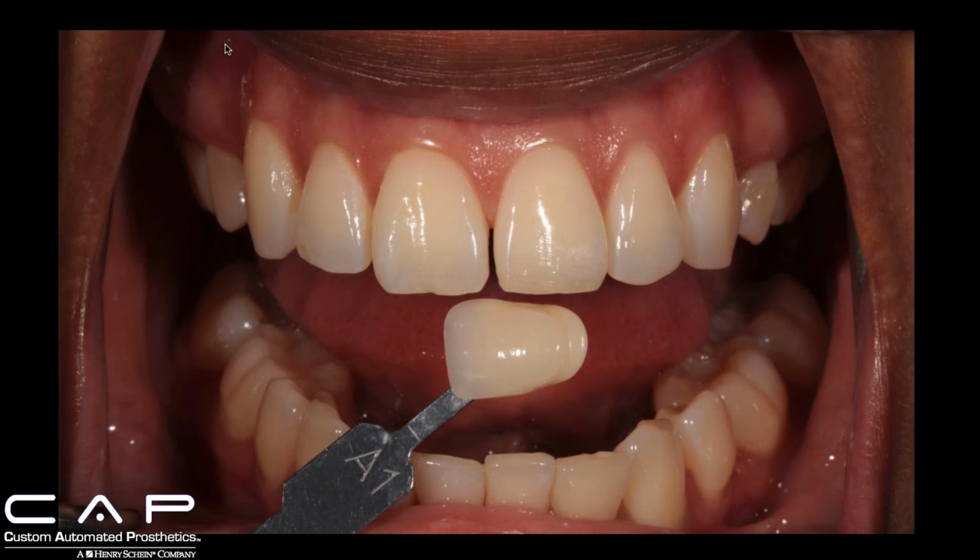So this is how I take a photo for basic shade taking. You can see she has her retractors in that she's controlling with her hands. I just simply tell her where I need her to position everything, and I go through my shade tabs, and I pick out the ones that I think are closest.